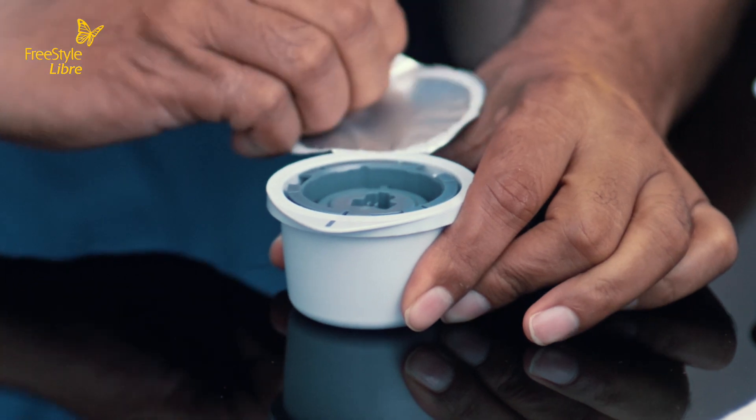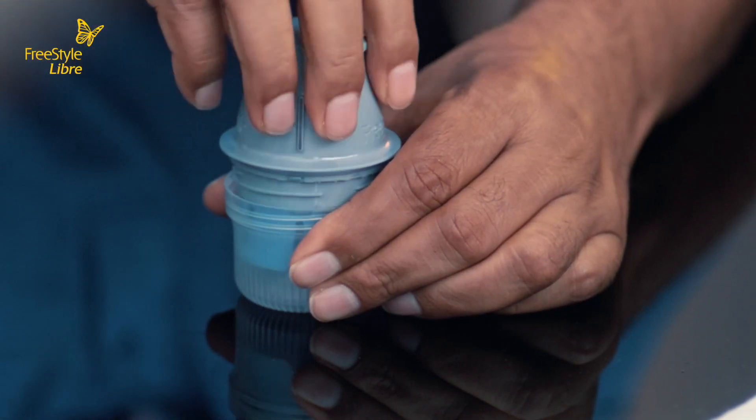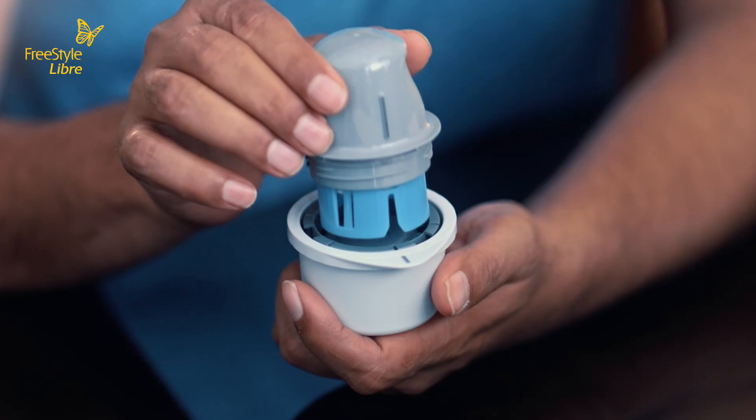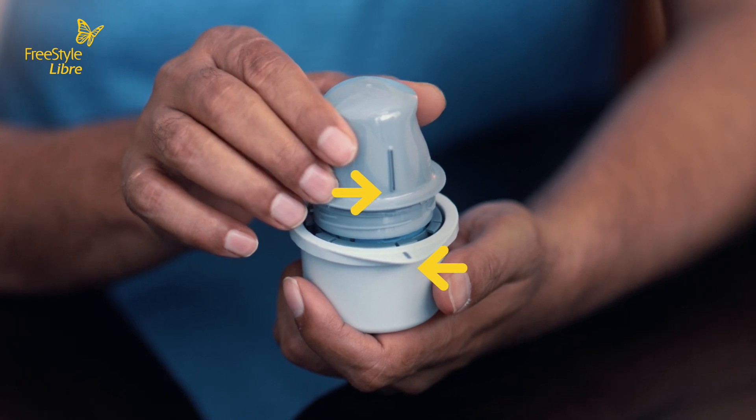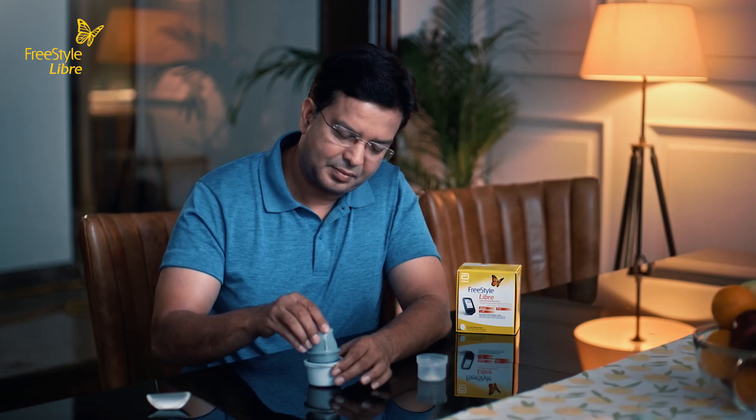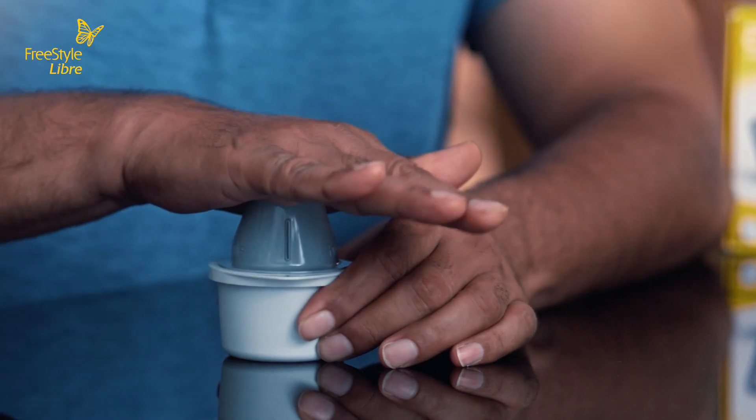Peel the lid completely off the back of the sensor and unscrew the cap from the sensor applicator. Place the sensor applicator into the open sensor pack. Align the dark mark on the applicator with the mark on the back. Place the applicator on a hard surface and press down firmly on the sensor applicator until it comes to a stop.